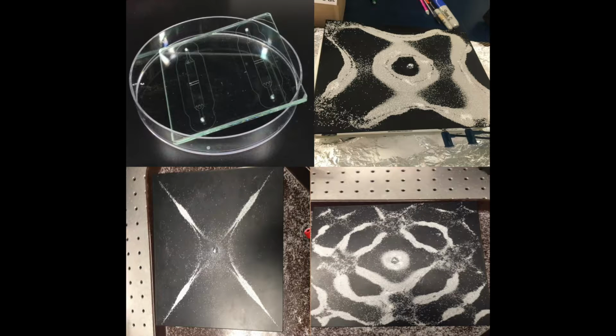We tested mung beans, salt, sugar, and silicon beads of different sizes focused at different rates. Powdered sugar showed antinode focusing as a result of its small size. We did not expect this to occur successfully, however it did.